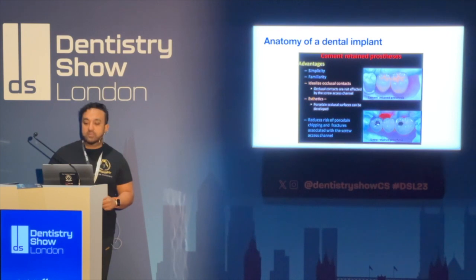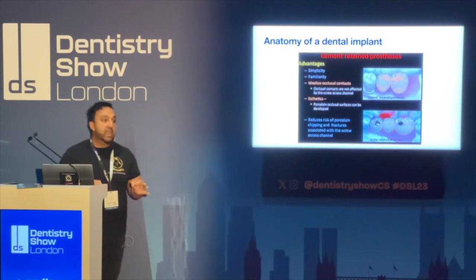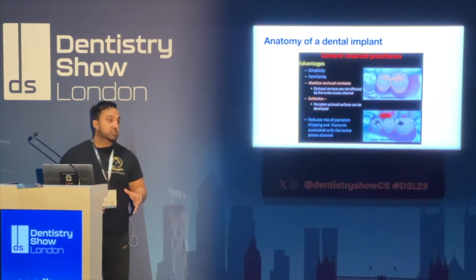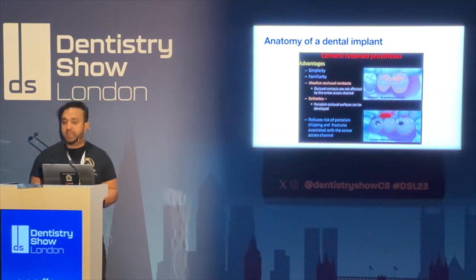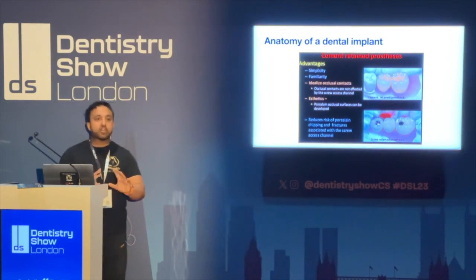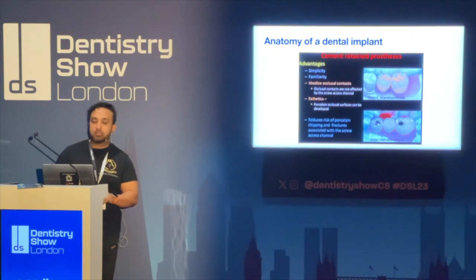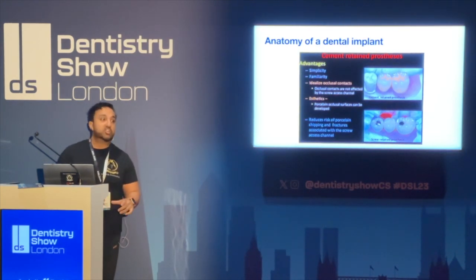The main thing also is when you have a screw retained prosthesis, you will have a little hole in your crown, and if your patient comes with a loose crown, it may be that just the abutment screw has loosened. This is quite a simple fix that every general practice really should know about: you drill out the composite, which is usually just flowable composite, and underneath the composite is either a small piece of cotton roll or a piece of PTFE tape. I usually use a barb broach to get the tape off, and then I'll get my universal kit out and try what will fit the screw head to see if we can tighten it up.